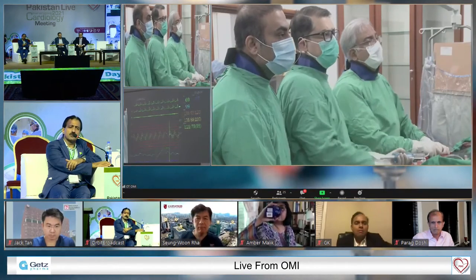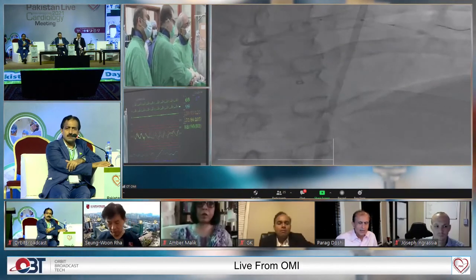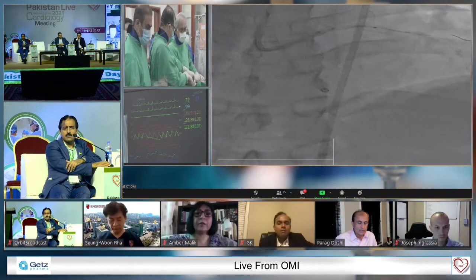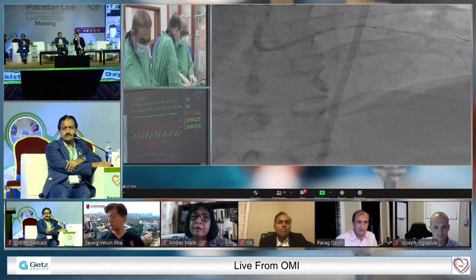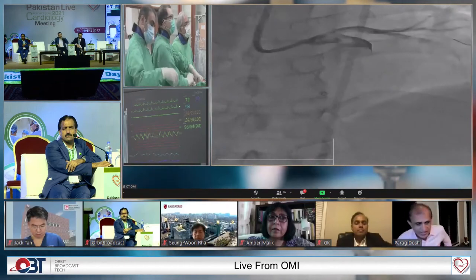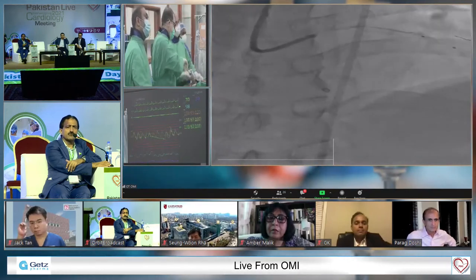Prague, what would be your choice? In this case, I do agree with one of the opinions that I would want to prove whether this is a relatively recent CTO. So once I have gotten my microcatheter in place, I would probe with Fielder XTA, which has been usually my wire to start probing. And of course, then I would decide based on how it progresses whether I continue with that or go with the Gaia series. Okay, Sohail, go ahead, please.